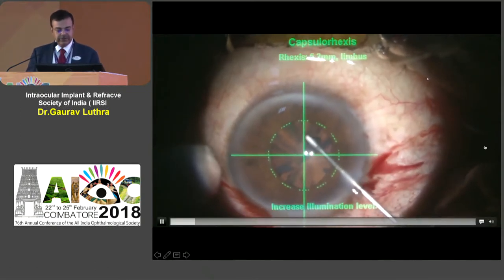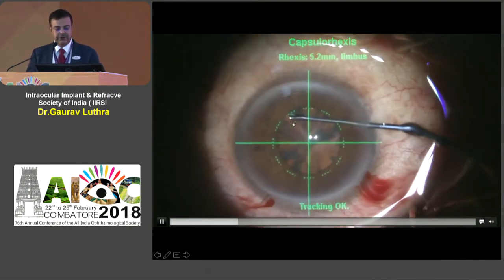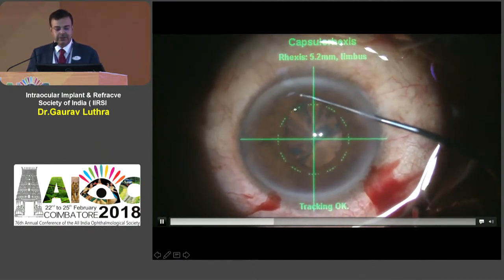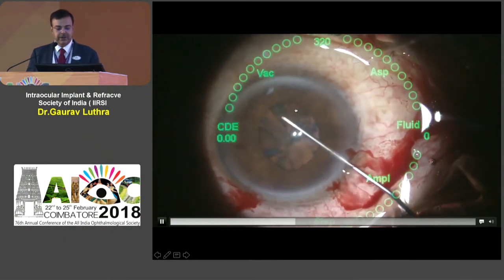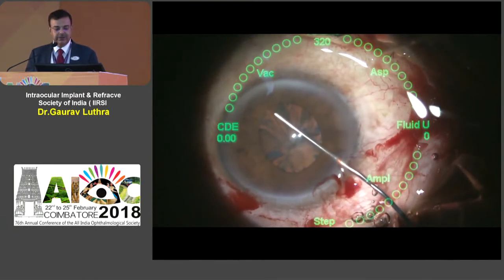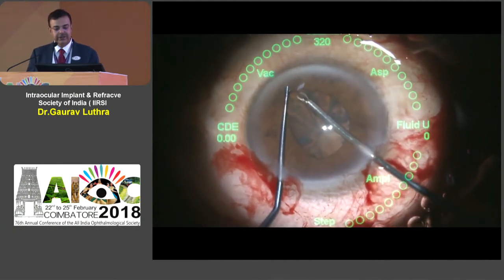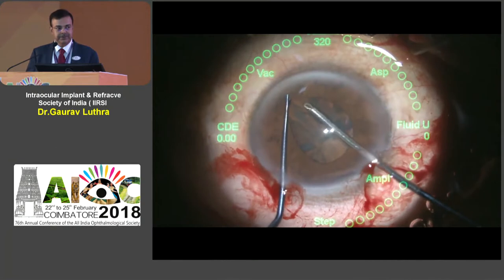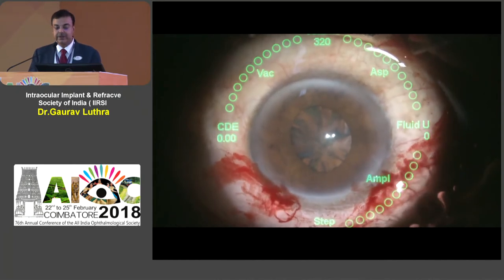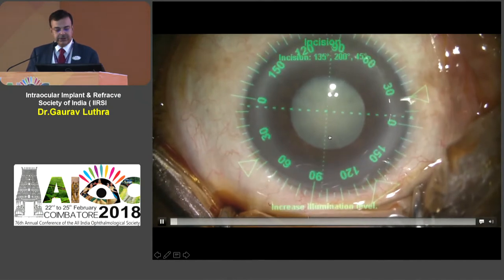There are other situations where the rhexis tends to run away. Here is a smallish pupil — as I was trying to make the rhexis following the Verion overlay, it ran out and came under the iris. I'm using a white-tipped manipulator to check where it went. Now I'm going to do a visco-mydriasis: in the area where the rhexis ran out I'm injecting viscoelastic, and you can see the pupil has dilated a little. I'll use a white-tipped spatula in the left hand to retrieve the rhexis using a bimanual technique.